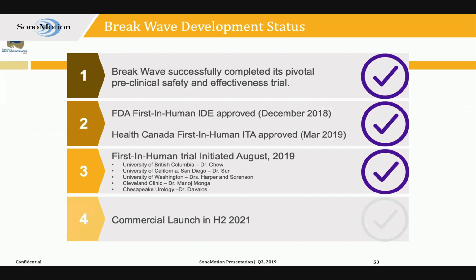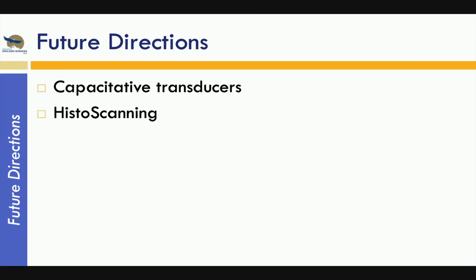And last thing is, she's working on a breakwave trial, and it's basically changing the frequency of waves to break up stones. There's a trial that's ongoing here, and conveniently also a trial going on in Queensland, where I'm headed next year. So those are other things that are up and coming with ultrasound technologies.